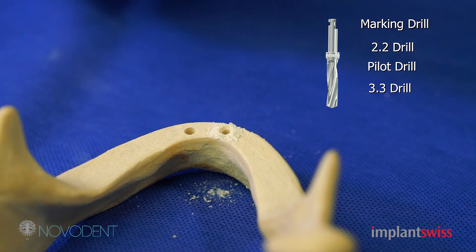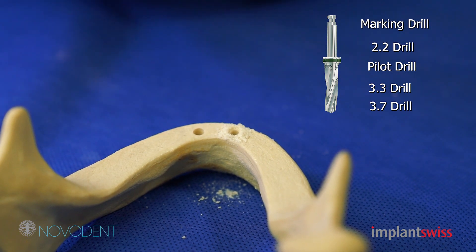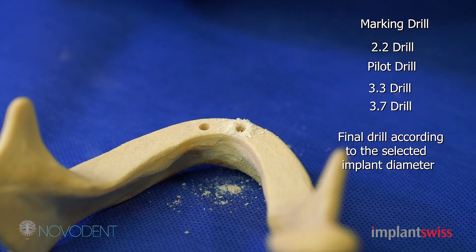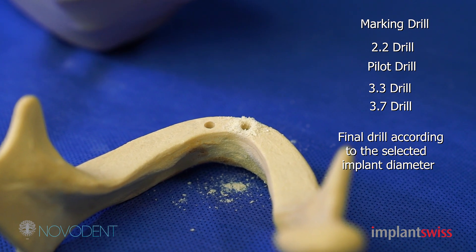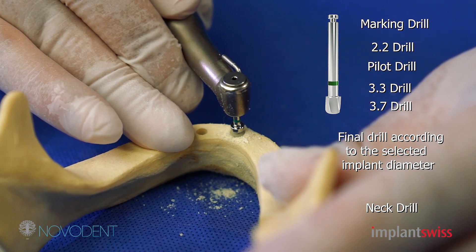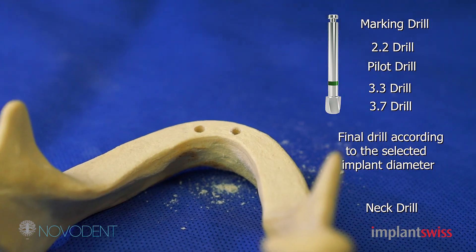Afterwards, if you place a 3.7 by 10, then this is the final fixture drill and you drill all the way down. In the mandible, when you have a hard cortical bone, you need to use something called a nick drill. This is the nick drill, as you can see it here. You drill the cortical bone, and that's it. Your osteotomy is done, as you can see in this diagram.